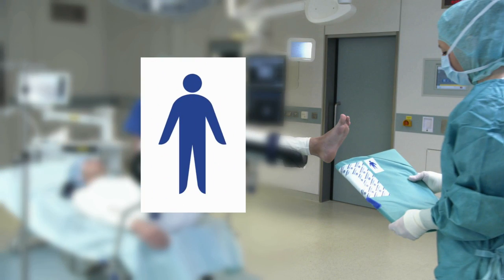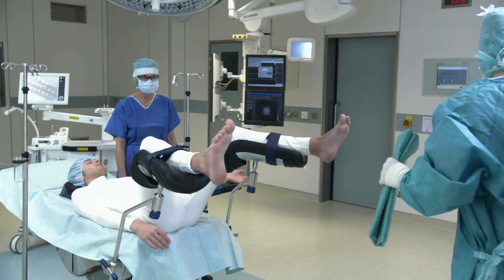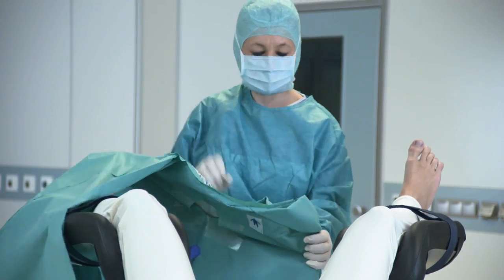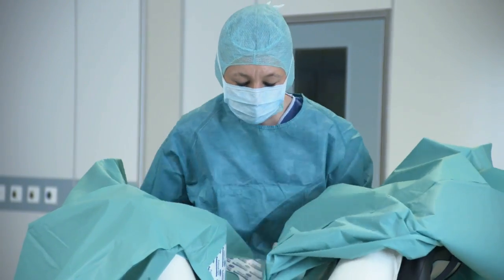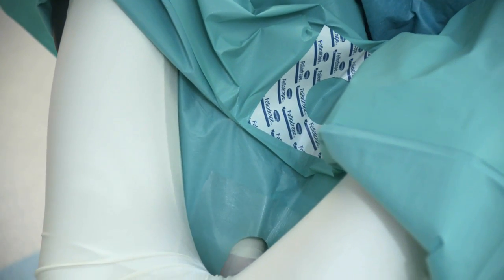Pictograms aid in orientation. The functional drape is folded in such a way that it can be fitted by just one person. The urology drape has a suprapubic and a genital aperture. The integrated latex-free finger stool provides additional safety and practicability.